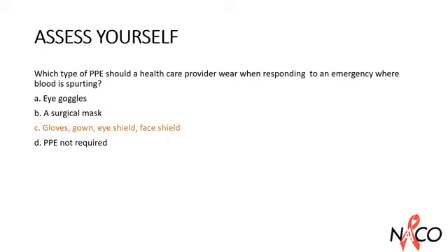The healthcare provider should wear gloves, gown, eye and face shield to completely protect himself from any blood splash.